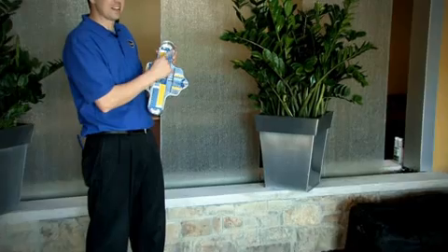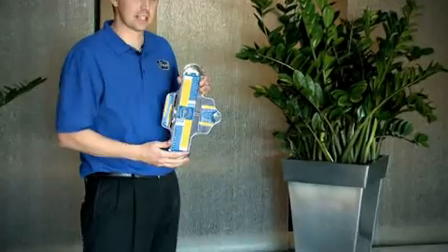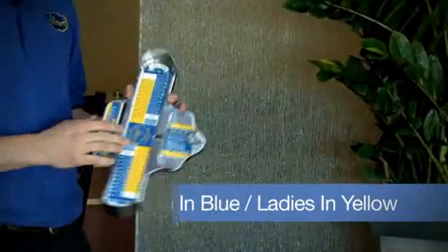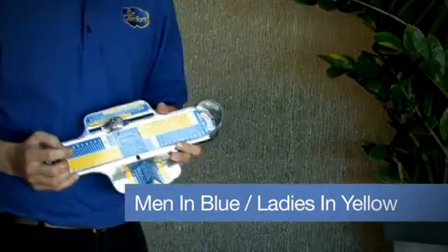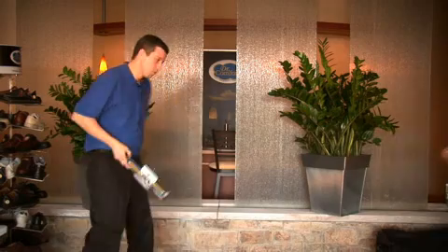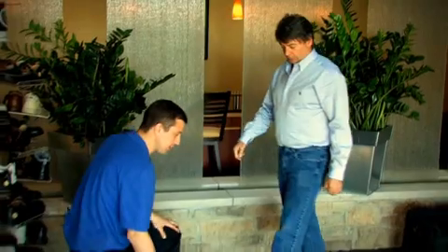The left foot or the left heel will go where it is indicated left heel, and the right heel where it says right heel. The men you'll find is in blue, and the yellow is for ladies. Now, we have our first patient here today. We'll have him walk in place right where he is.